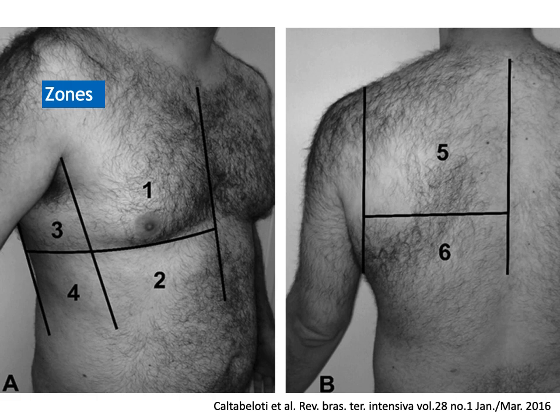structures. So the next will be talking about the systematic scanning zones, and it's important to put in our consideration that there is no validated scanning protocol yet, but this is one of the simple protocols that I use in my daily practice, in which I divide each lung into 6 zones, and the zones are divided by a horizontal imaginary line running across the nipple line, and the anterior line, which is the parasternal line, the anterior axillary line, the posterior axillary line, and the paravertebral line posteriorly. And this will give us 2 anterior zones, 2 lateral, and 2 posterior zones.